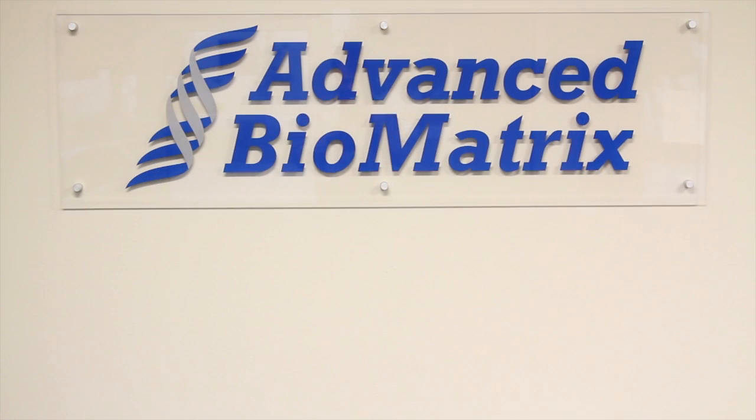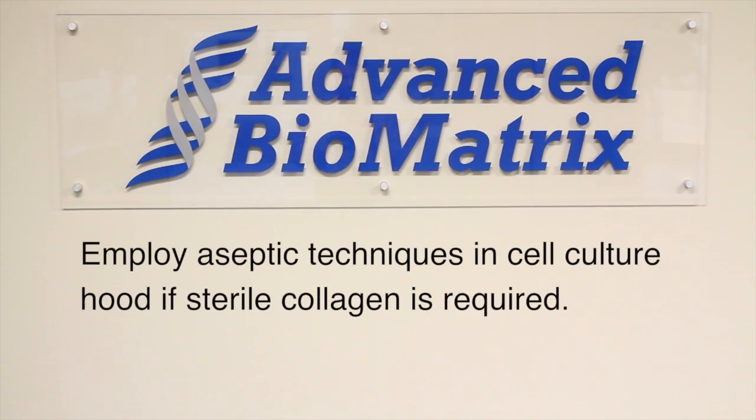Many of you will be using the collagen for cell culture, which requires a sterile collagen gel. If this is the case, employ aseptic techniques in a cell culture hood.